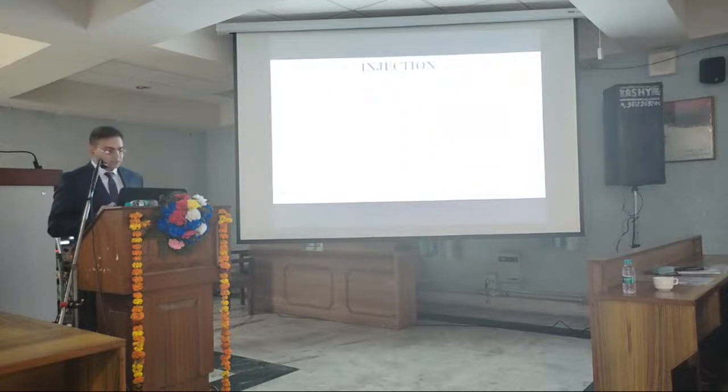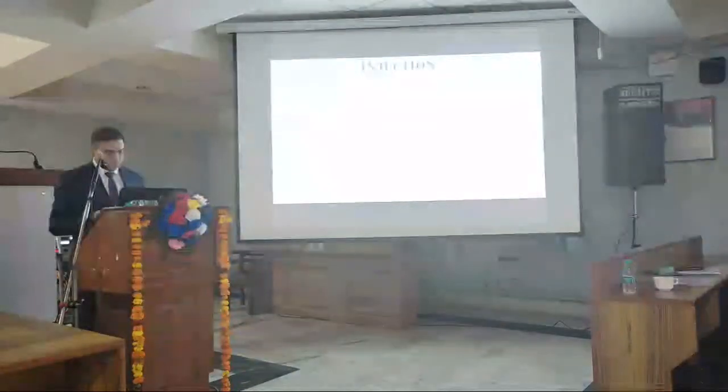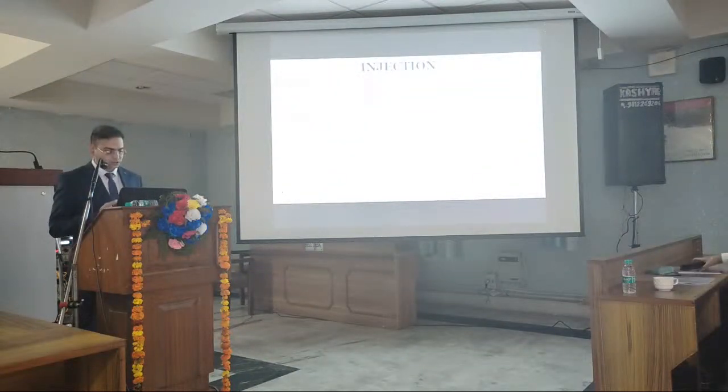Now, there are pros and cons of all the techniques, but most centers prefer periareolar injection. But the ideal one is combining both techniques, giving superficial injection in the form of periareolar and deep injection in the form of peritumoral. Intratumoral injections are avoided because they have chances of tumor seeding through the needle tract.